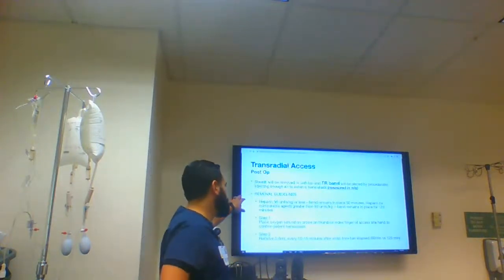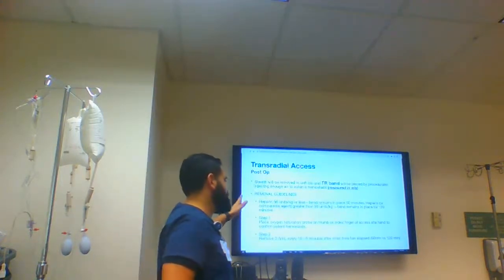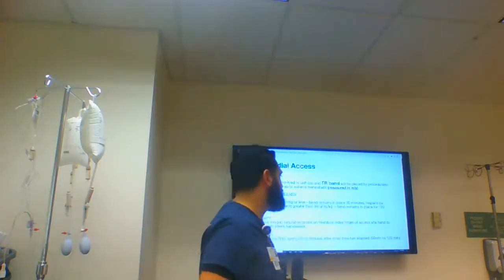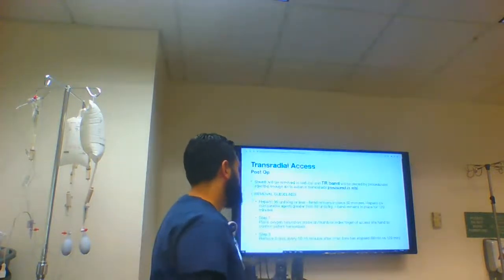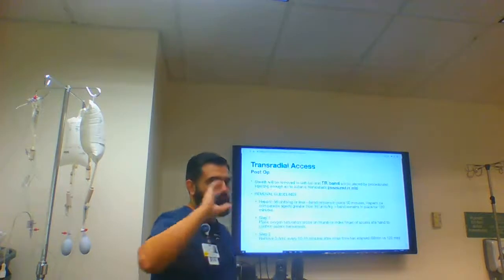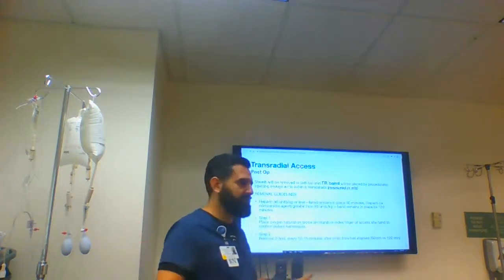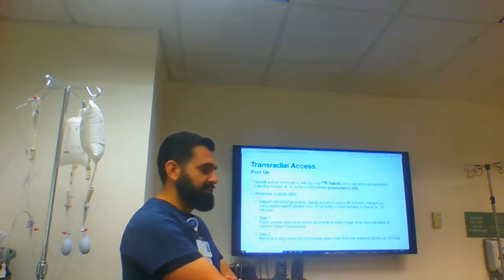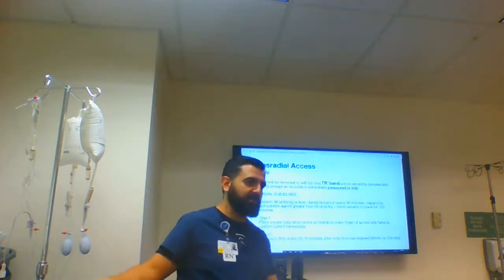So removal guidelines: if they received heparin 50 units per kilo or less, the band remains in place for 60 minutes. If they received more than 50 per kilo, it'll remain in place for 2 hours, on its own, without you messing with it or doing anything. But it's important that you immobilize it. Us at the clinic, we immobilize it immediately.